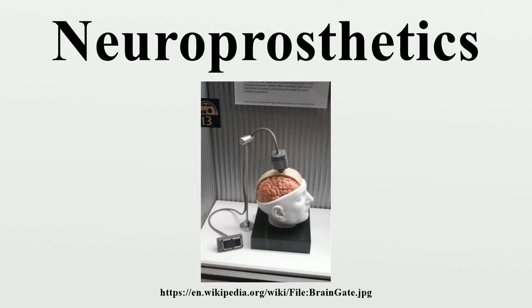Accurately probing and recording the electrical signals in the brain would help better understand the relationship among a local population of neurons that are responsible for a specific function. Neural implants are designed to be as small as possible in order to be minimally invasive, particularly in areas surrounding the brain, eyes or cochlea. These implants typically communicate with their prosthetic counterparts wirelessly. Additionally, power is currently received through wireless power transmission through the skin. The tissue surrounding the implant is usually highly sensitive to temperature rise, meaning that power consumption must be minimal in order to prevent tissue damage.